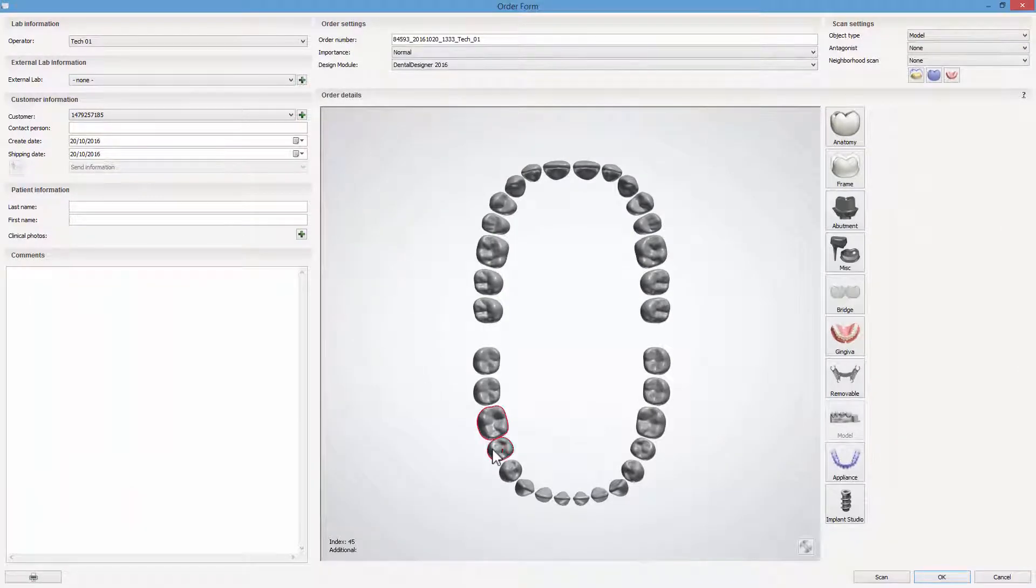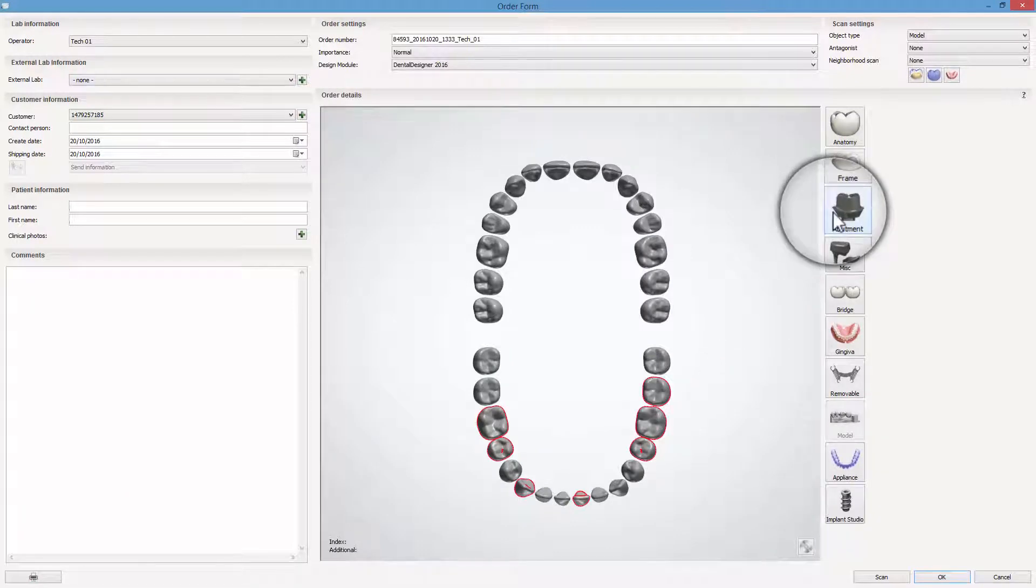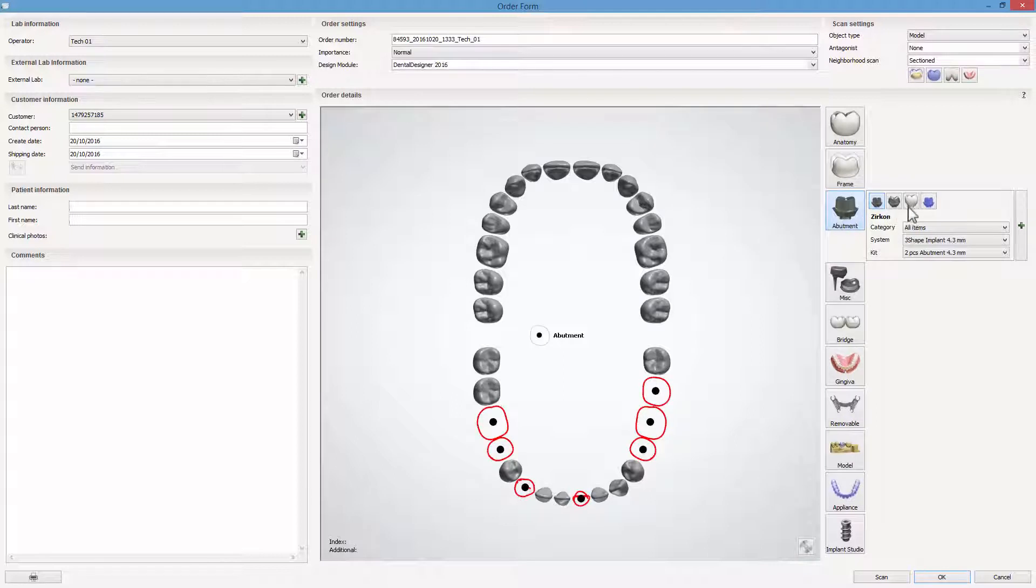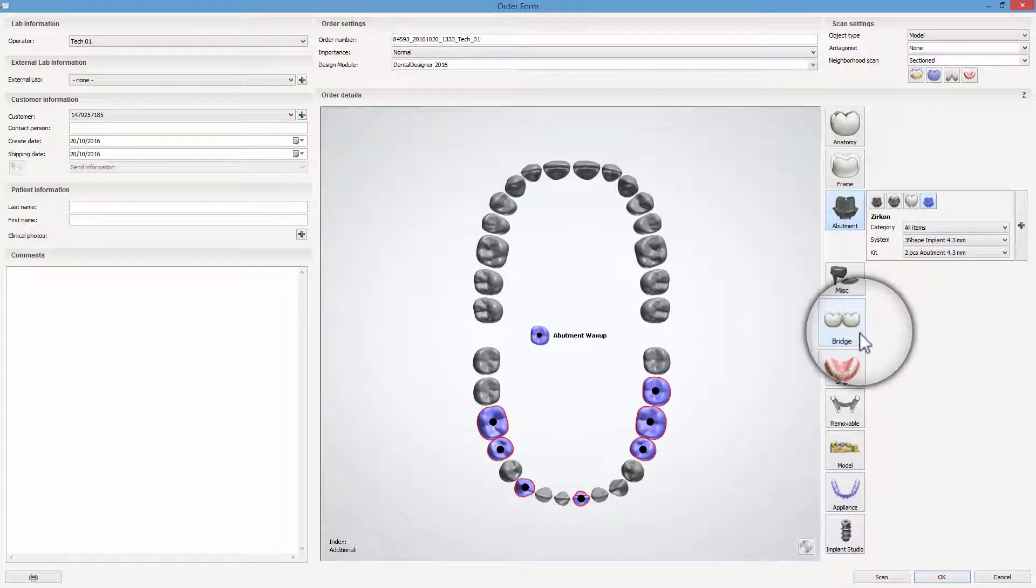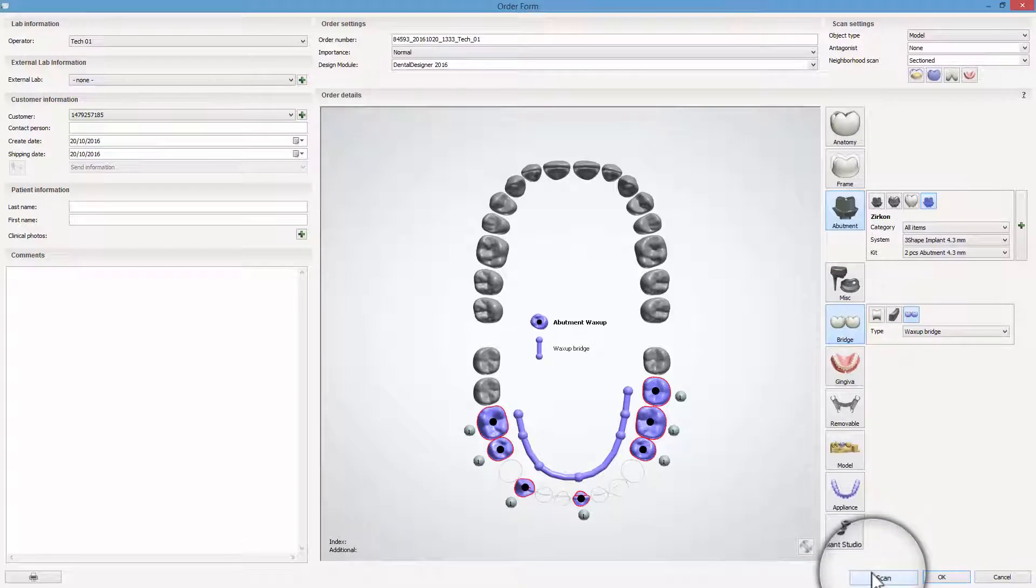Select Preparation in the Tooth Overview field. From the Abutment menu, choose Wax Up Abutment. After that, click on the Bridge menu button. Once the order is set, click Scan.